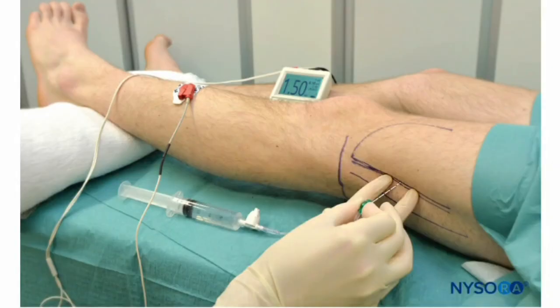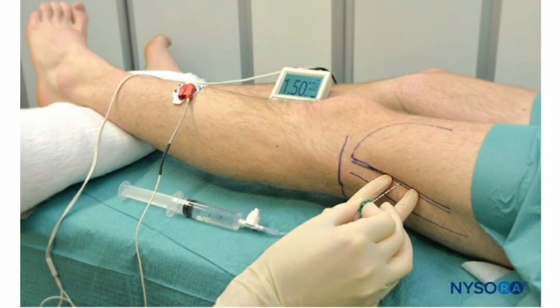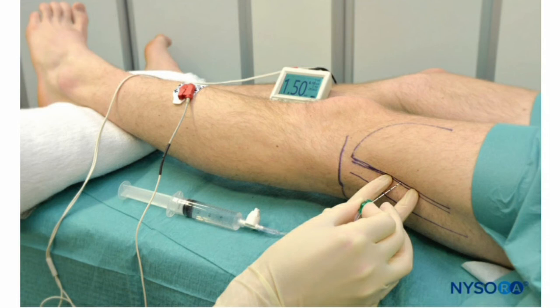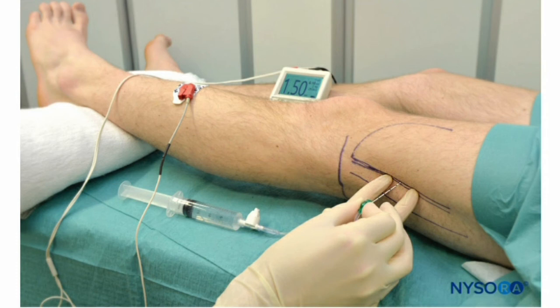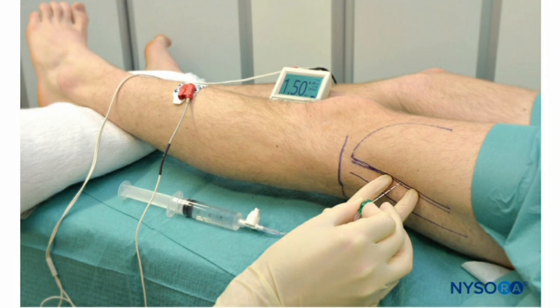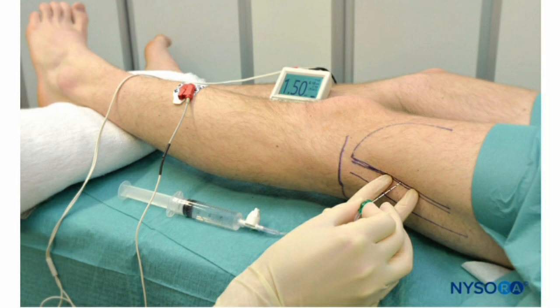Landmarks for the lateral approach to popliteal block include the popliteal fossa crease, the vastus lateralis muscle, and the biceps femoris muscle. The needle insertion site is marked in the groove between the vastus lateralis and biceps femoris muscles, 8 cm proximal to the popliteal crease. A 10 cm, 22-gauge needle is connected to a nerve stimulator and inserted in a horizontal plane between the vastus lateralis and biceps femoris muscles.